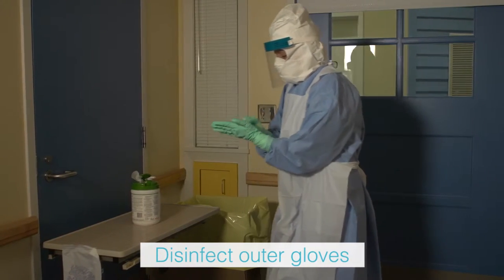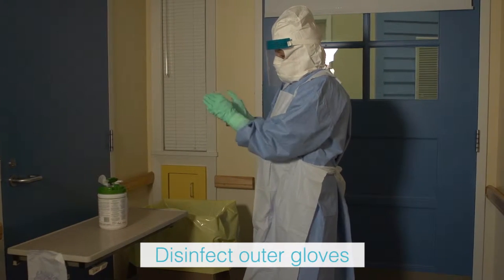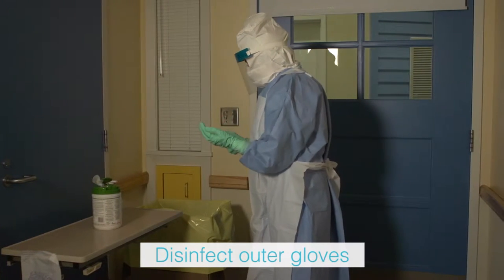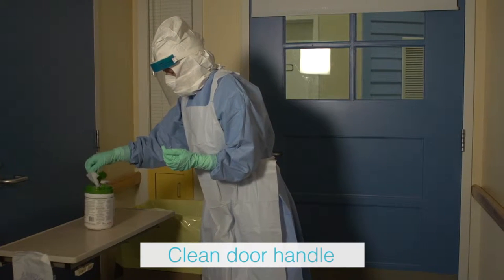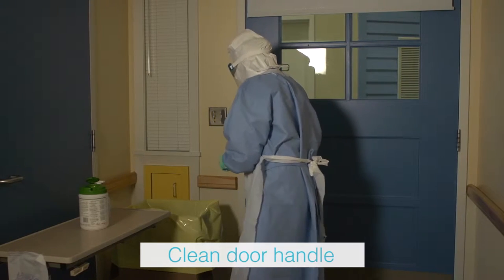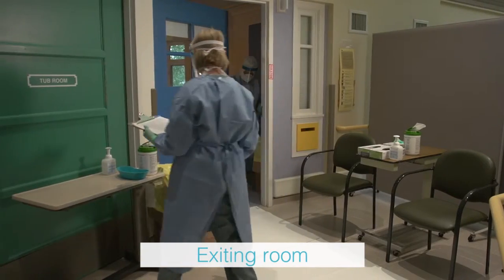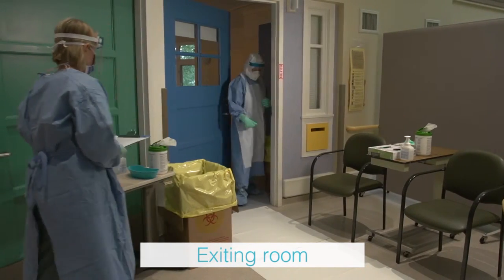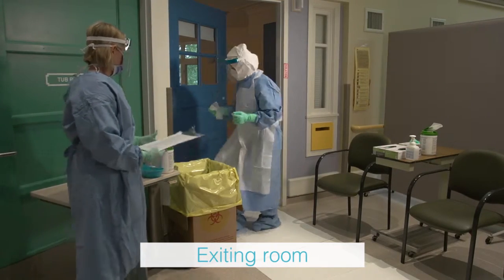Use a hospital-grade disinfectant wipe to clean outer gloves prior to opening the door and allow the gloves to dry. Use a new disinfectant wipe to clean the door handle prior to opening. The health care provider steps out of the patient room onto the first doffing mat, then uses a new disinfectant wipe to close the patient's door.